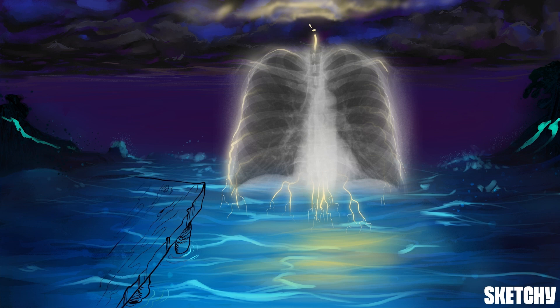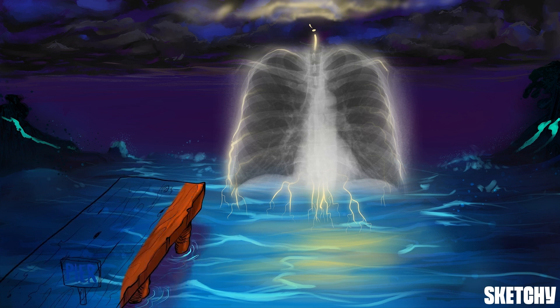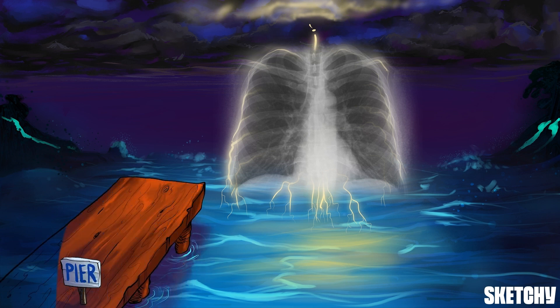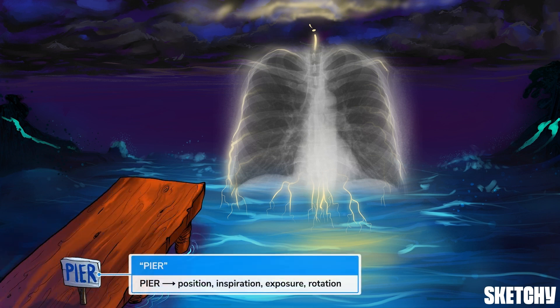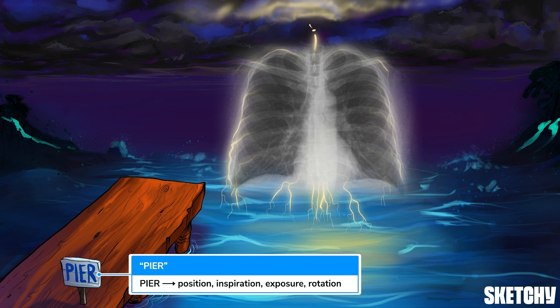To analyze a chest x-ray, it's helpful to have a high-quality image. There are four key factors that contribute to quality. To remember them, have a look at this PIER, which stands for Position, Inspiration, Exposure, and Rotation.